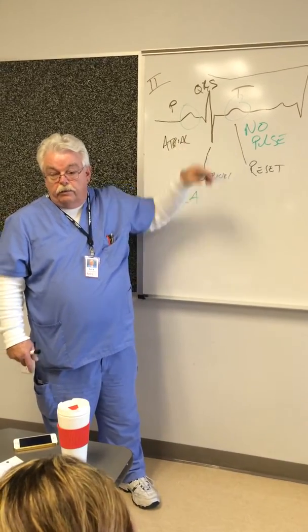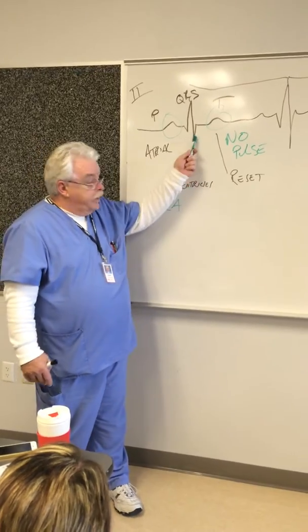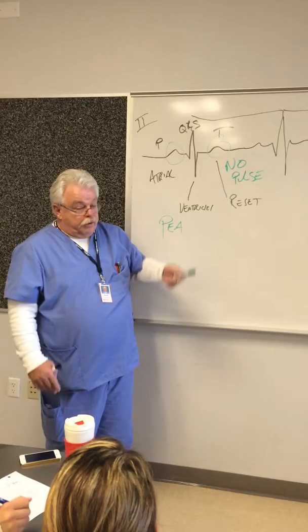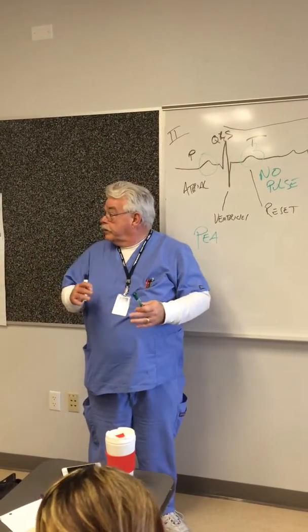You know this strip really well, you can't get the other ones wrong. That's what makes this so easy. There's only one right answer, and that's this. So, everybody understands sinus tach now? Everybody understands sinus brady? Okay, those are the easy ones.